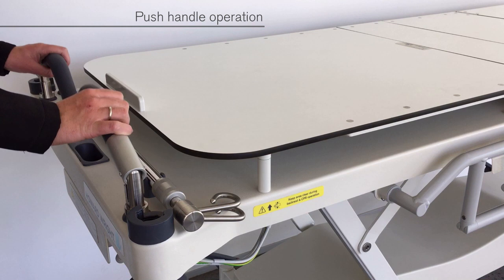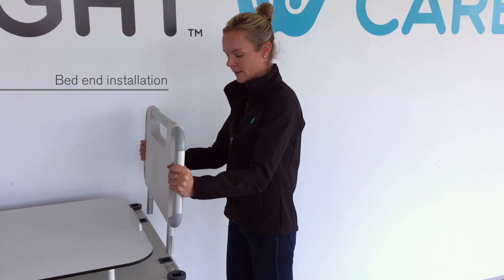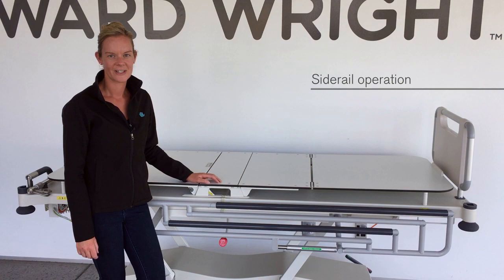Push handles are located at the head end. To raise, lift and lock. To fold away, lift and lower. A bed end is also available and can be installed at the foot end by lowering the pegs into the sockets.